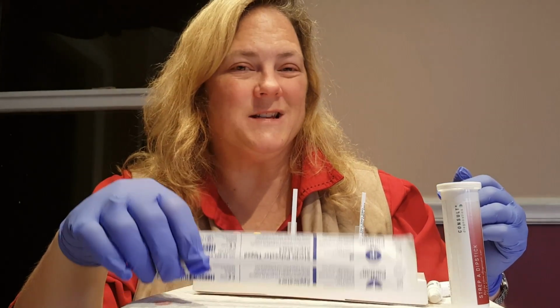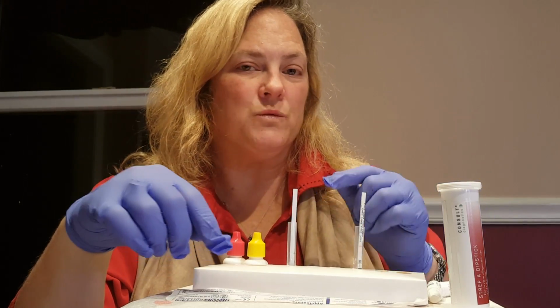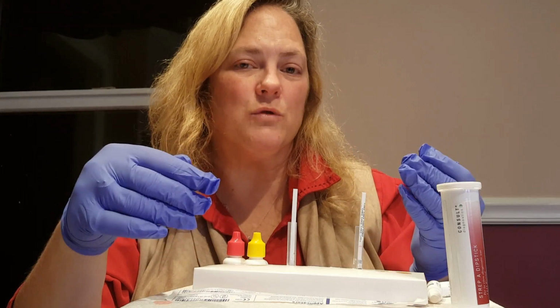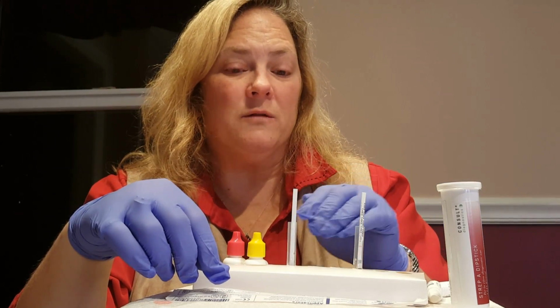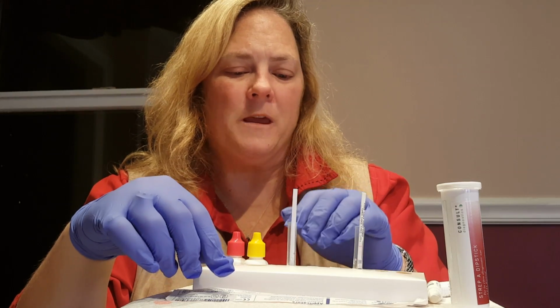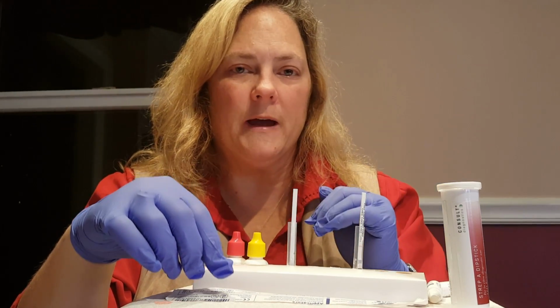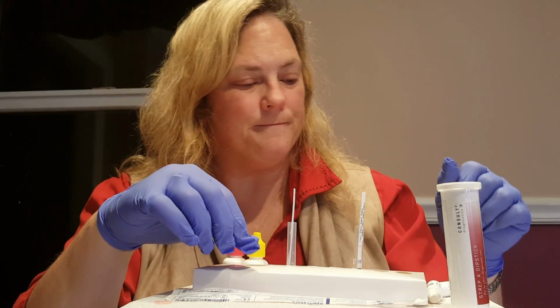Without a proper testing sample, you may get some false negative results, which is one of the reasons why we send the sample often when it's negative to the lab for further analysis, because it's a more sensitive test in the lab. Strep throat can cause a very serious infection if it is left untreated. So it's why we have a double check on that test result to ensure we haven't missed anything.